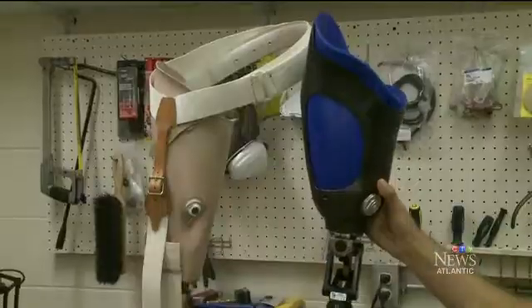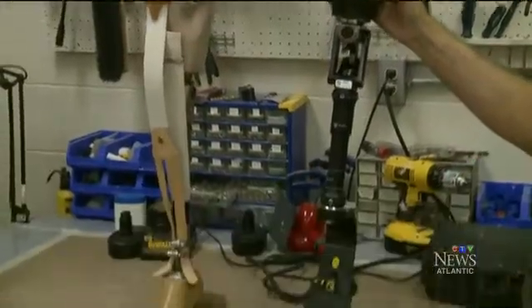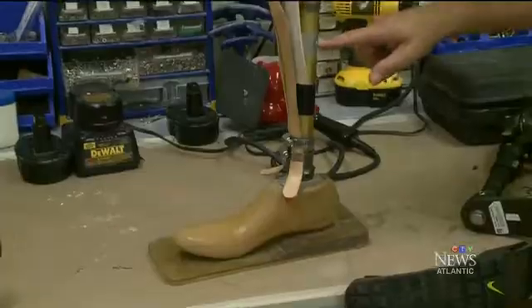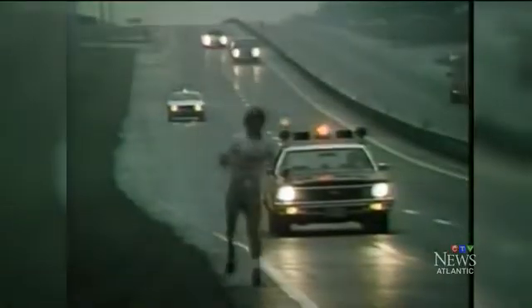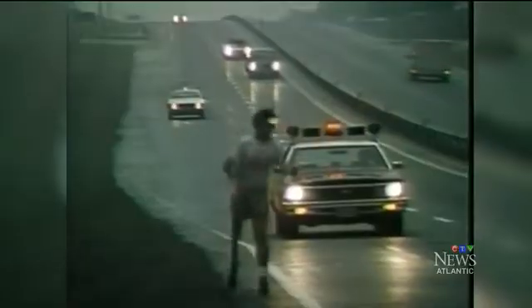Modern prosthetics like this one are lighter, conserve energy, and are much more comfortable than the one Fox used. One of the only modifications to Fox's leg were elastic straps for his knee, causing his famous hop-skip gait. "It would be really interesting to see if he would have had the chance to run on that type of technology, if his journey would have been any different."